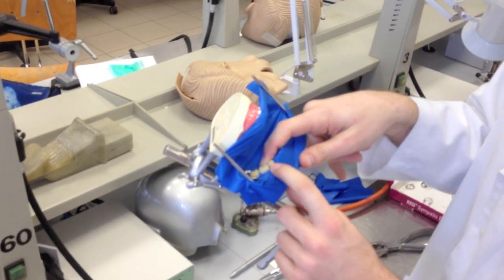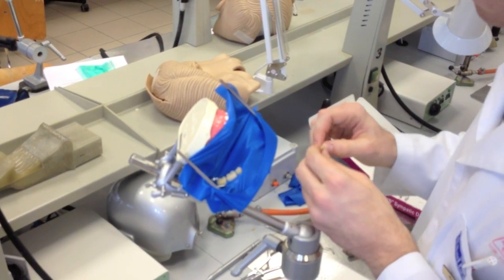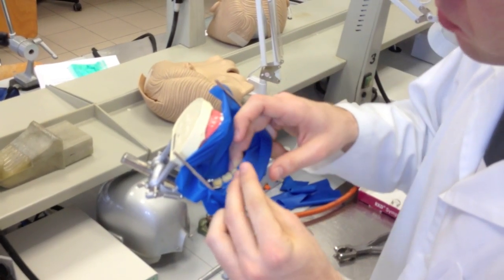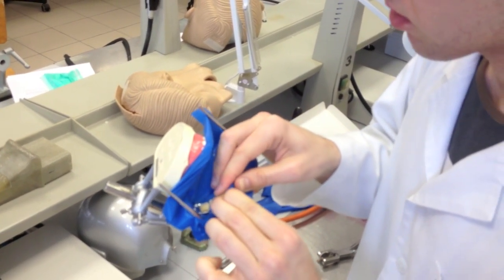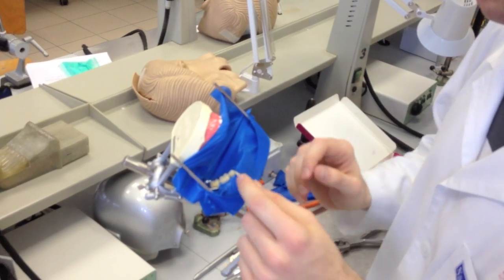Here we don't need any mesial fixation. But if it's necessary, for example, you can use a wedge — pull down the rubber and place the wedge, then it's much more fixed. But sometimes it's not necessary.